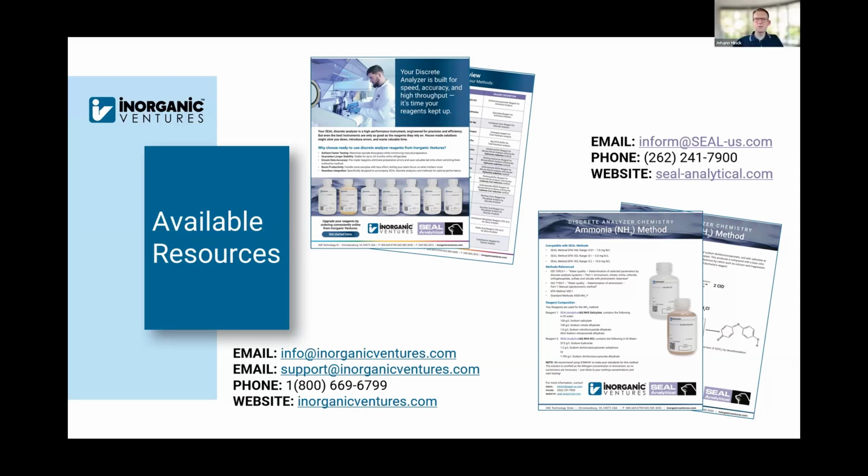Liv, I'm curious, have you noticed or do you remember if you've seen that NED reagent turning pink over time in your testing? I know the room temperature one definitely has. I'm pretty sure the refrigerated one still looks pretty good. I mean, like you said, a slight tint, but we filter it and it's fine. Nice.